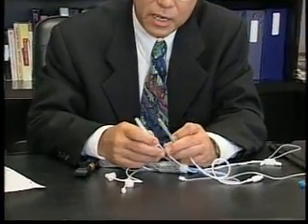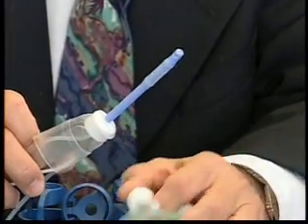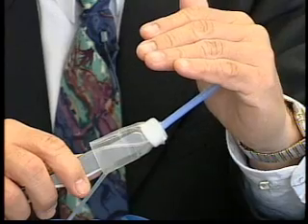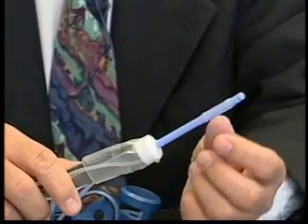Hence, at all times we use a cup that is appropriately sized but not too large. It is also important not to use a cup that is too small, as it will not fit over the cervix and the advantage of the device is then lost. Regarding the uterine manipulator tip: there are three sizes, and if a uterus sounds to, for example, seven centimeters, we would not use the eight centimeter tip but instead size down to six centimeters. If the tip is too long, its end will abut against the uterine fundus, preventing the cup from fitting into the vaginal fornix. A shorter tip will always allow the fornix to be put on stretch by the cup.